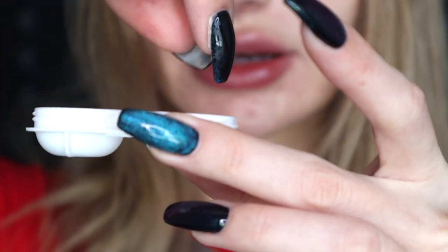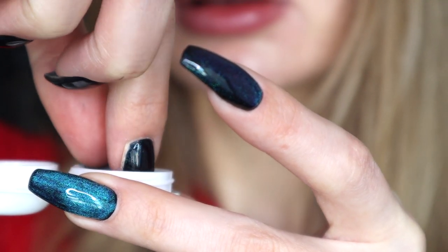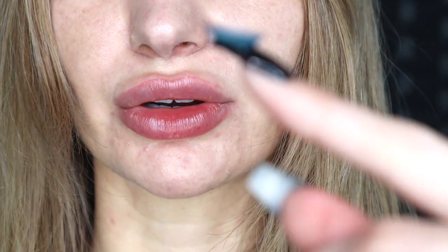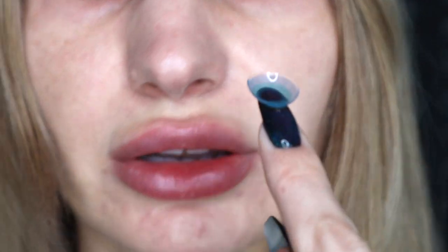I store my colored contacts in this little container, so literally this is what you will need, and a mirror — but I'm going to be using my viewfinder. Get your contacts ready. I'm going to start with my left eye because it's easier for me. Before you start, make sure to wash your hands so they're nice and clean. Take your contact lens and apply it right on the tip of your right index finger.